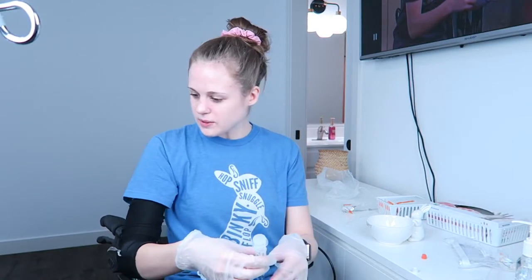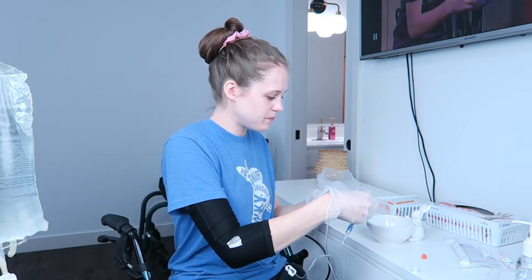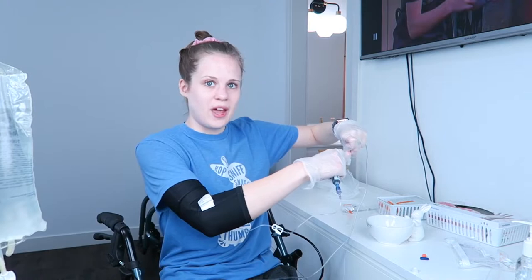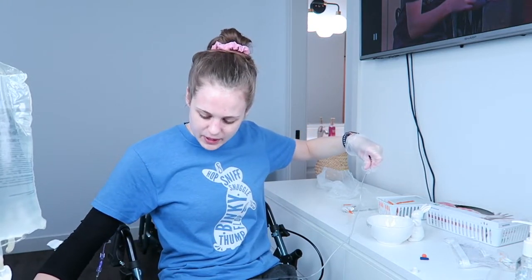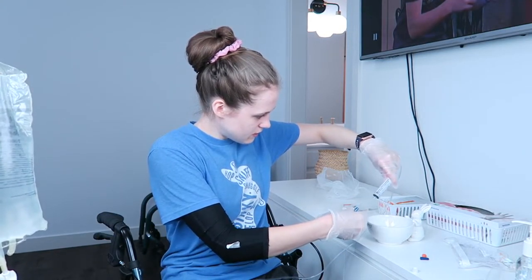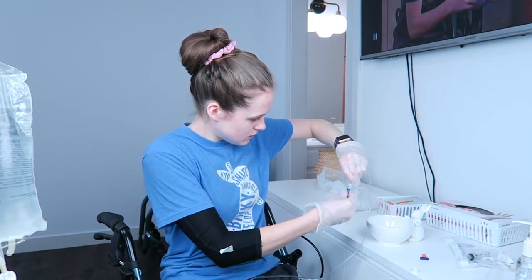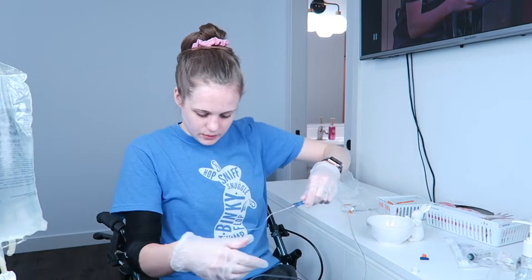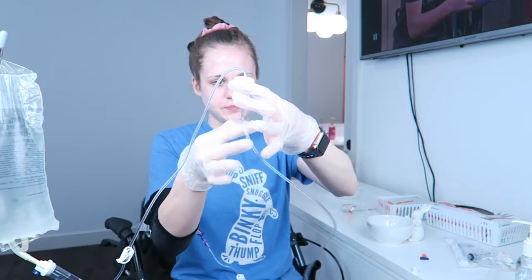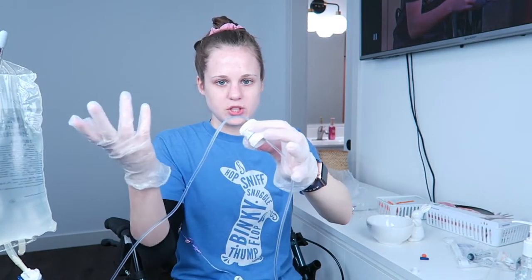Now what I'm going to do is go over here and grab my tubing. I'm going to take this cap off the end of the tubing, and I'm actually going to run a tiny bit more fluid out, because there's probably some air at the end of here and I don't want that air getting in my line. Take this off, drop that, connect. There we go. Oh, there's a little bubble here. I'm going to get that out. If there's a bubble here, I'm just going to flick it. It's either going to travel back up, and I believe this has an air filter in it, so the bubbles just kind of disappear when you do that.